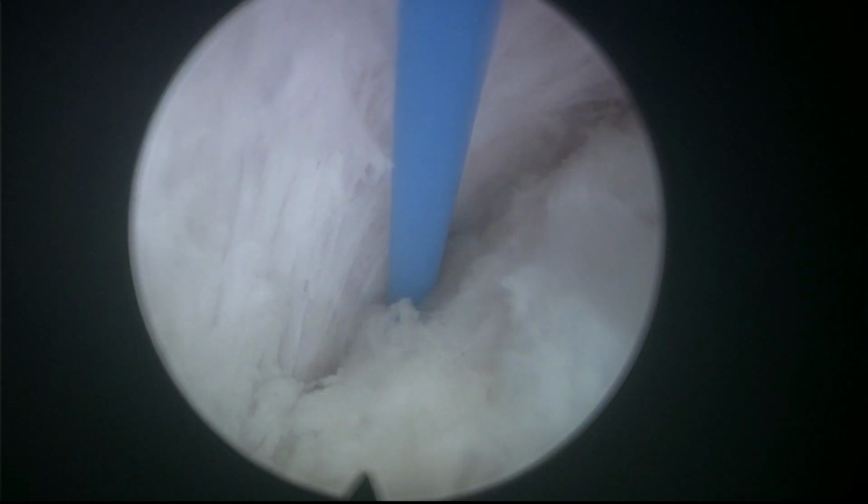So all this en-bloc enucleation technique and the early apical liberation and the white line and all these concepts, I think, are improving. As you can see, I am using a new fiber. I don't know what happened. It is quite unusual to have to change the fiber throughout the procedure, but obviously something happened.